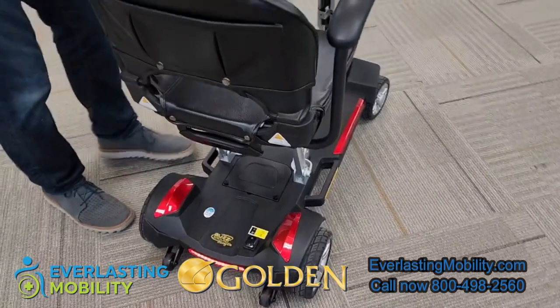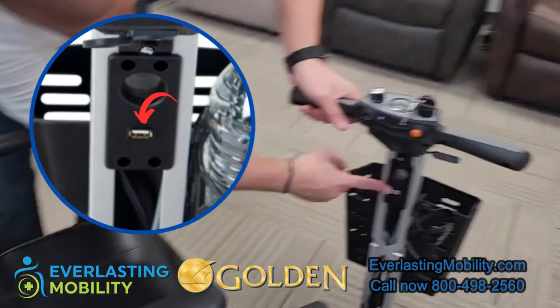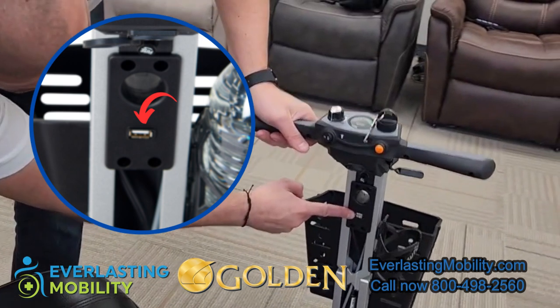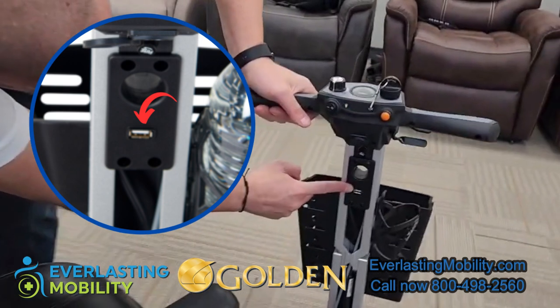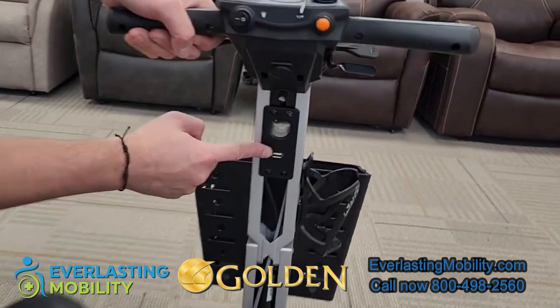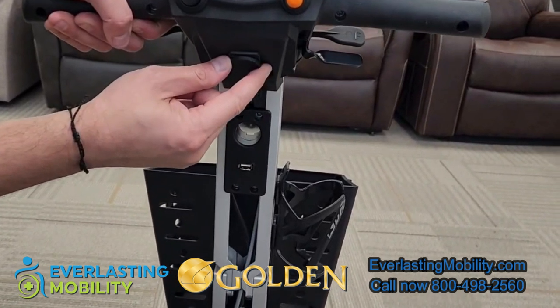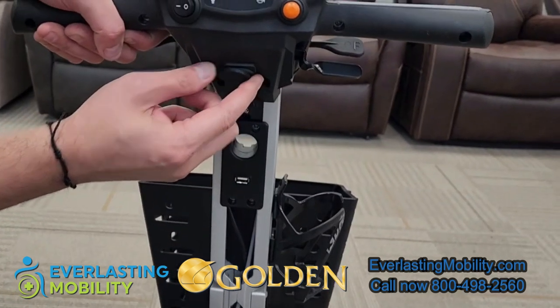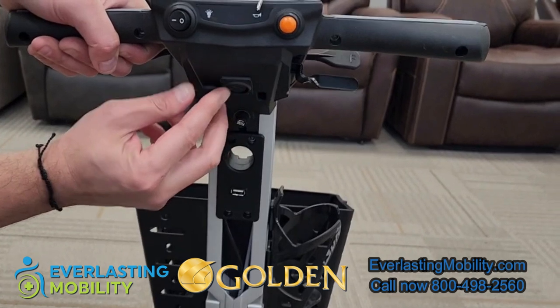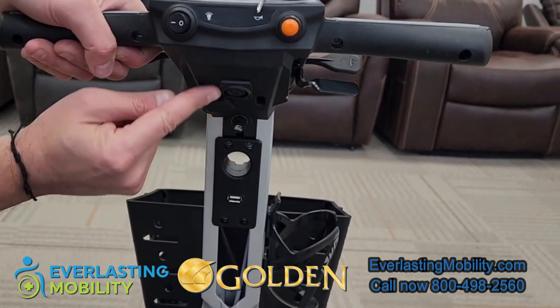On the tiller there is a USB charging port so you can charge your phone, tablet, or a Bluetooth speaker while you're traveling. The charging port for the scooter itself is also on the tiller, right below all the controls — you just slide the cover off and plug it in, so you don't have to bend over to charge the scooter.